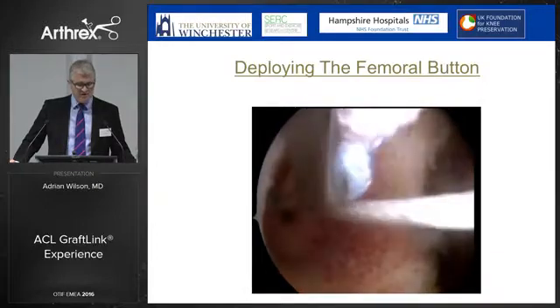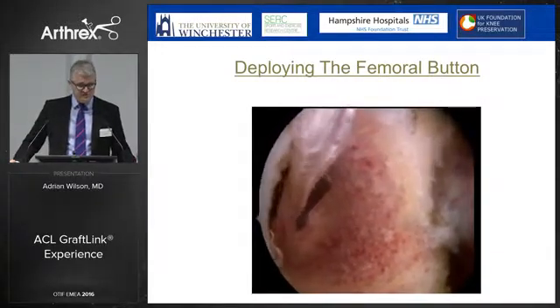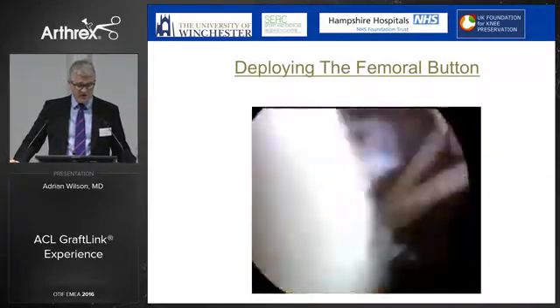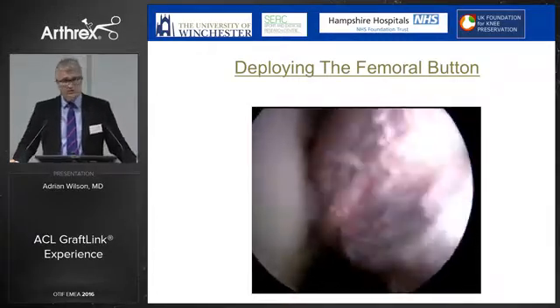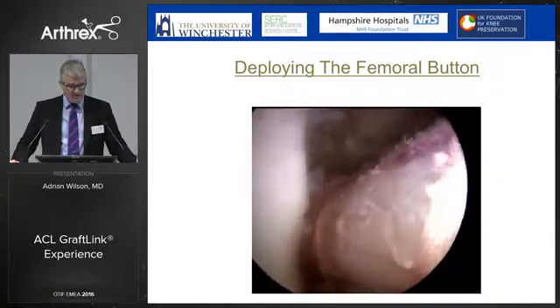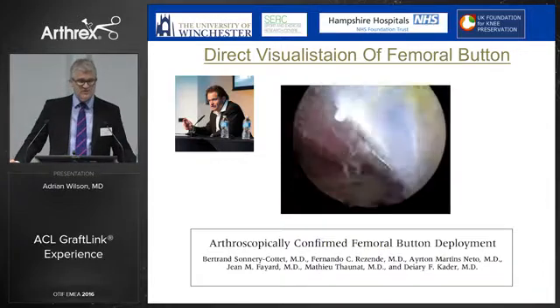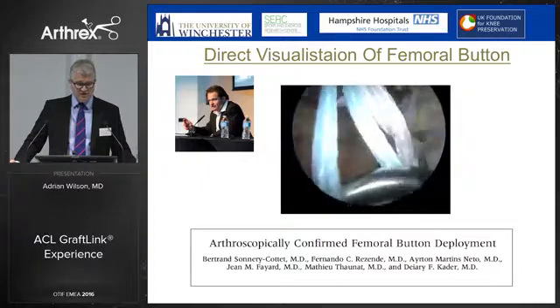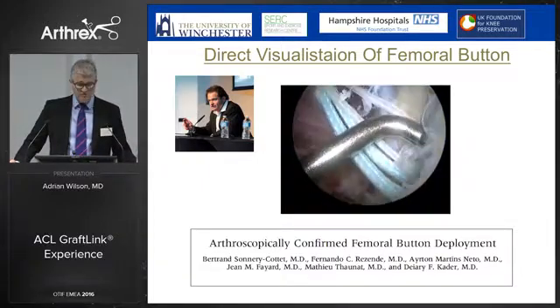This is a very clever idea that came from Bertrand Sonnery-Cottet, which is direct visualization of the button. Here we can watch it going through the pilot hole, and then externally we can simply move the scope into the lateral gutter, and we can then look with direct visualization and watch the button externally. So here we have the internal view, and then it's very simple just to move the telescope into the lateral gutter and seek the button under direct vision, which gives you a lot of security as you're leaving the theatre that the button is in the right place.